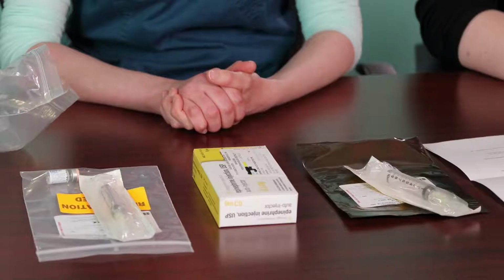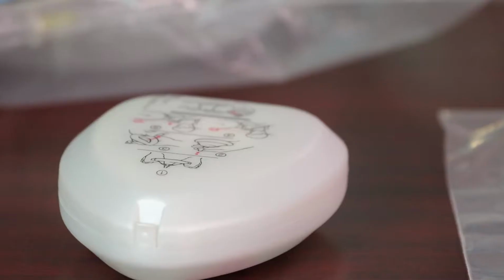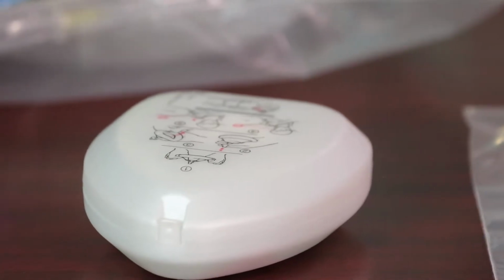After you set up your medication for mixing, before you begin to mix, you first have to set up the anaphylaxis kit for your patient. This needs to be on a separate clean surface within a reasonable distance to the patient location. First, you'll take out the anaphylaxis orders and set up the medications in the same sequence as laid out on the orders. If you're missing anaphylaxis orders, missing a medication, or if anything is out of date, you cannot proceed until you contact the home infusion pharmacy. Be sure to have your mask for CPR.